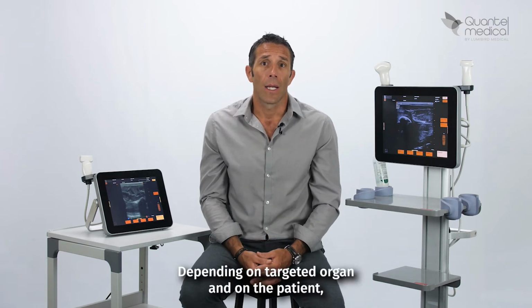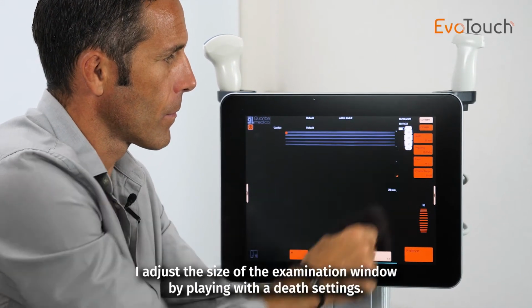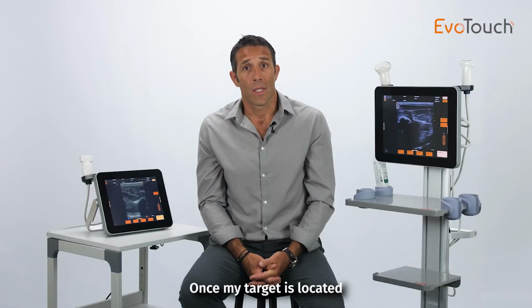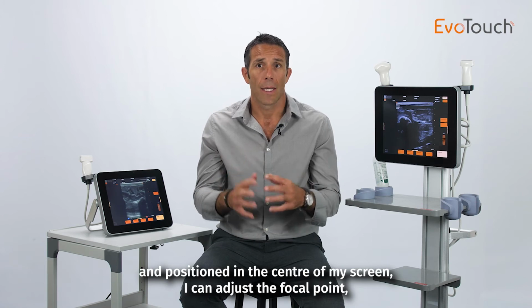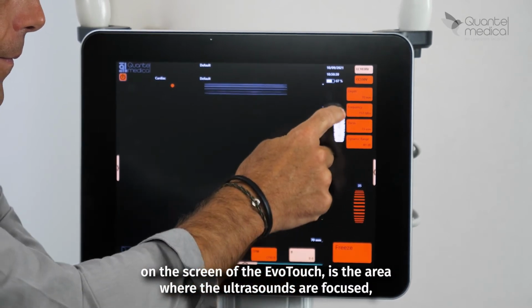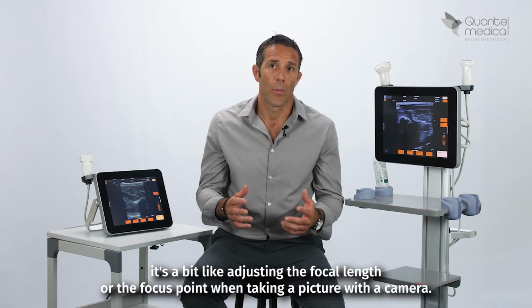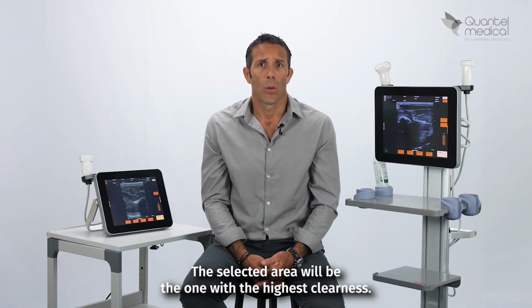Depending on the targeted organ and the patient, I adjust the size of my examination window by playing with the depth settings. Once my target is located and positioned in the center of my screen, I can adjust the focal point. The focal point, represented by the orange arrow on the screen of the EvoTouch, is the area where the ultrasound waves are focused. It's a bit like adjusting the focal length or the focus point when taking a picture with a camera. The selected area will be the one with the highest clearness.